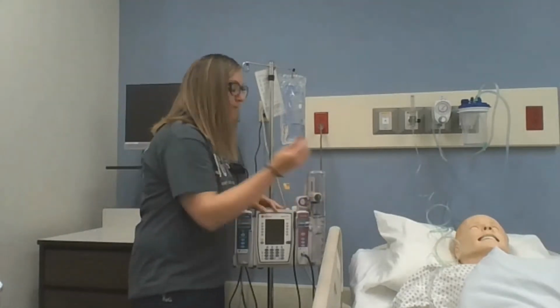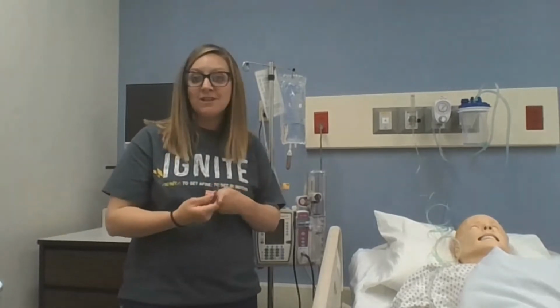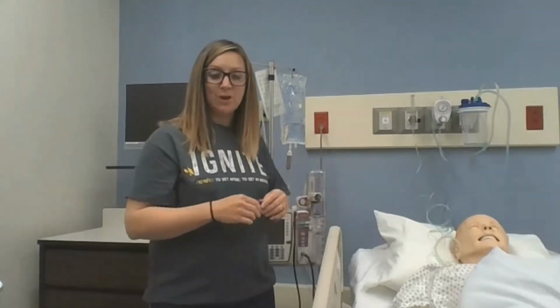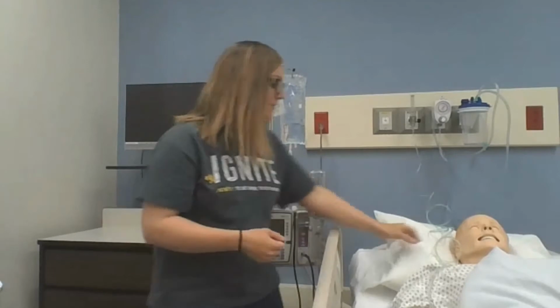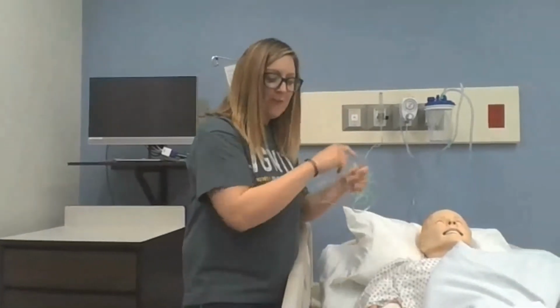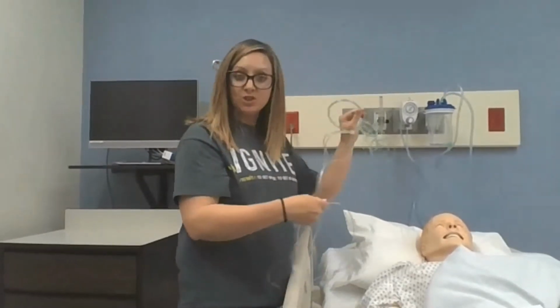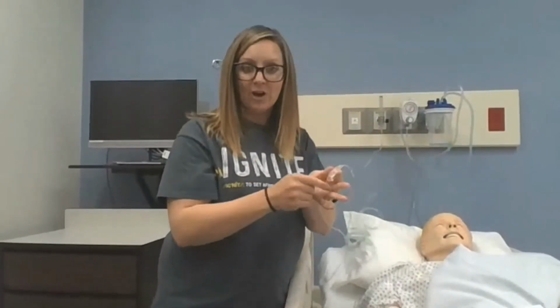So you have to make sure that you have, obviously, a vital sign machine at the bedside, which we're fortunate to have in every room, because they're going to be on the continuous SpO2 monitor. You need your flow meter. You're going to grab this tubing here out of the medication room, and it's usually on that metal rack across from your Omnicell, and it has this O2 tubing that looks kind of crazy, and it has this little flap right here attached to it.